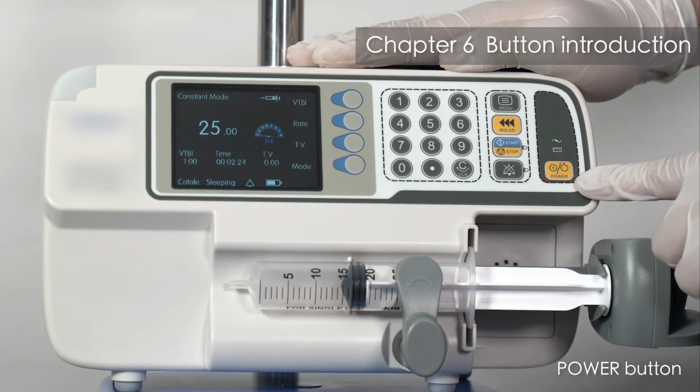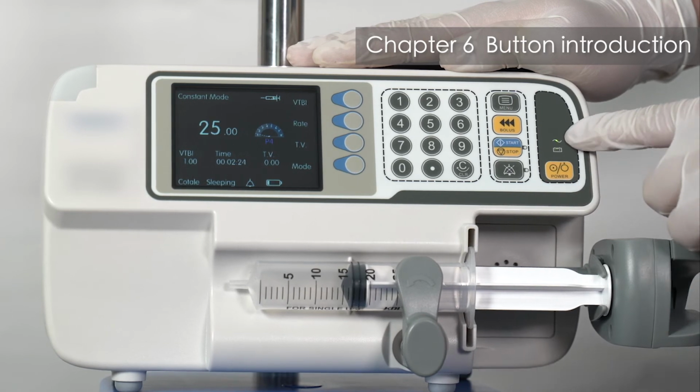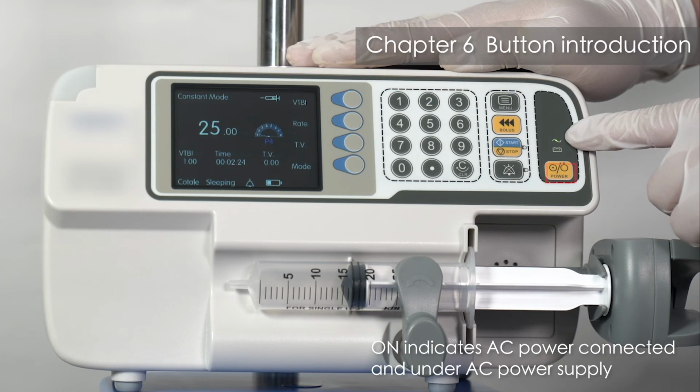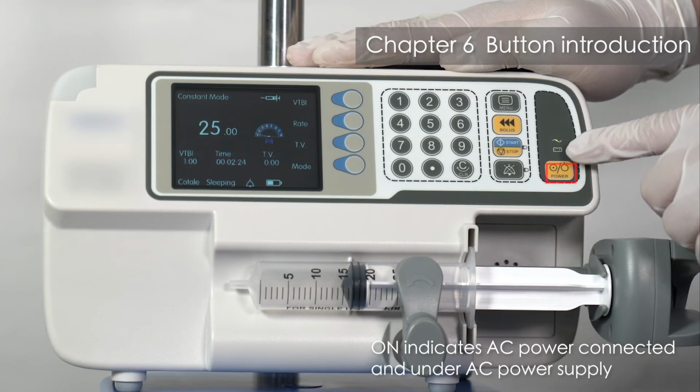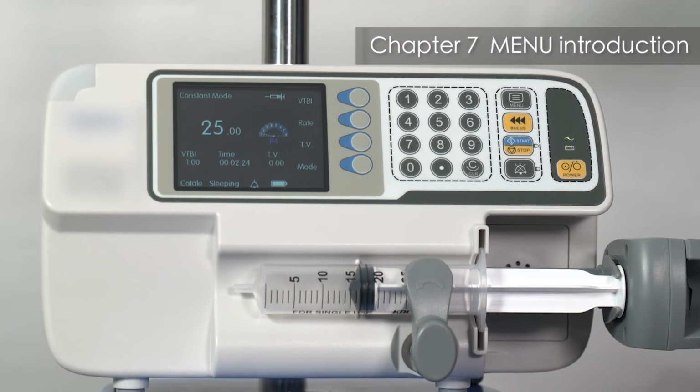Power button. Long press to power on or off. Power indicator. On indicates AC power connected and under AC power supply. Battery indicator. On indicates under battery supply. Flashing indicates battery charging.